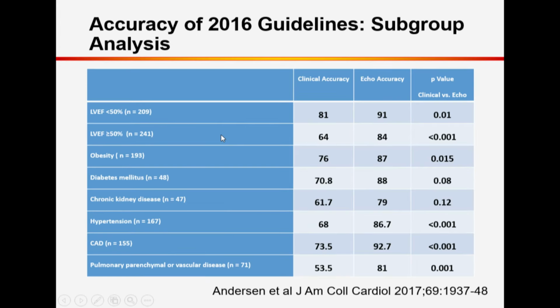Significant difference, and when you look at subgroups, groups that are particularly challenging, obese, patients with pulmonary disease, very decent accuracy. Not perfect, but acceptable and certainly useful clinically.